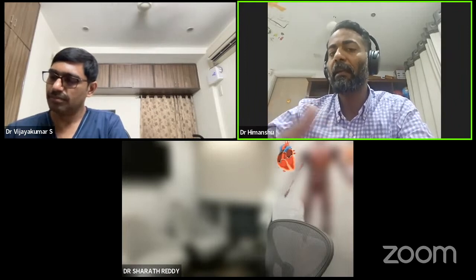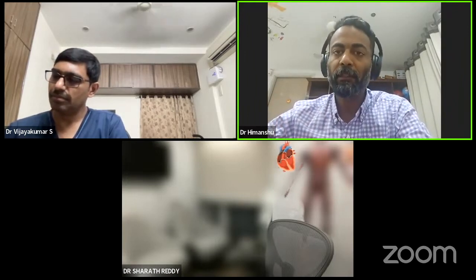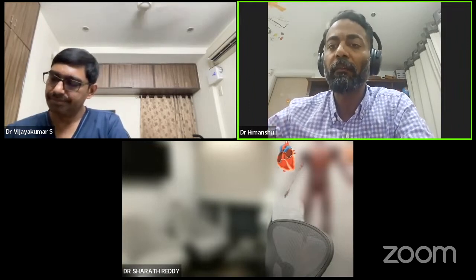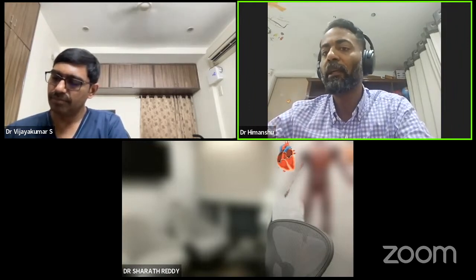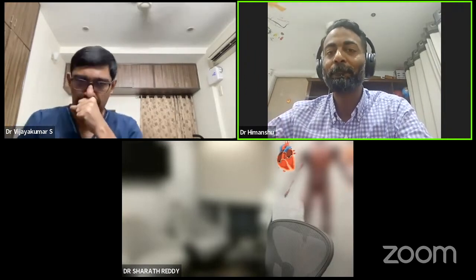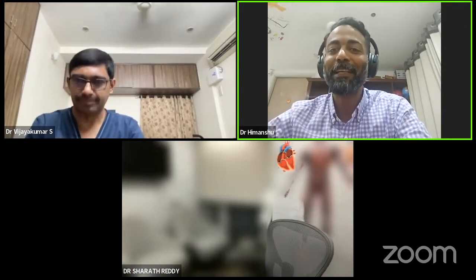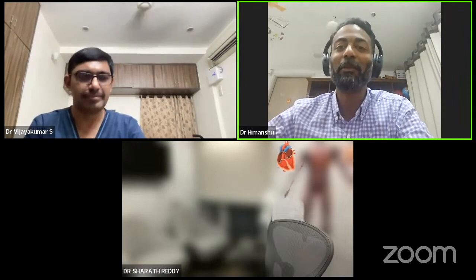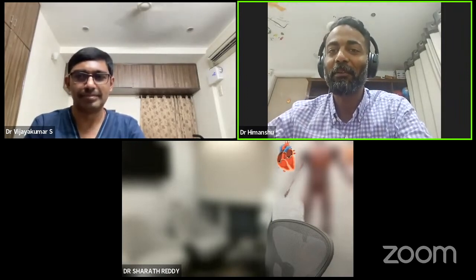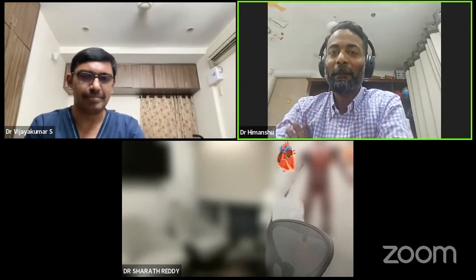Here, coming to the technical part, of course, this is a technical forum, so it is a forum for investment procedure. So this procedure is shouting out investment from the outset. We know it is not going to succeed antegrade, and there are very few retrograde options, and that is why it is being presented in this webinar. But of course, then you need to have experience in investment also. So that is what we should learn. So I think we can go to the case and see how Dr. Sharath and his very nice team were able to do this procedure.